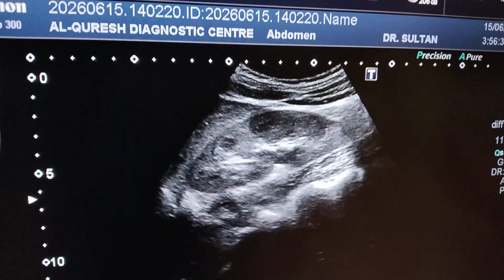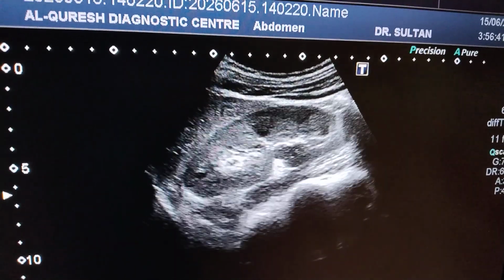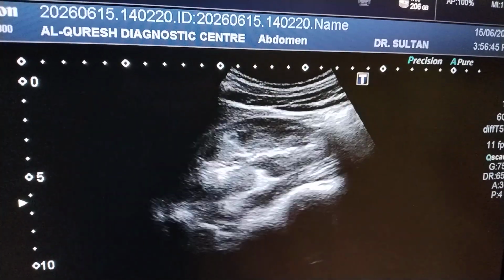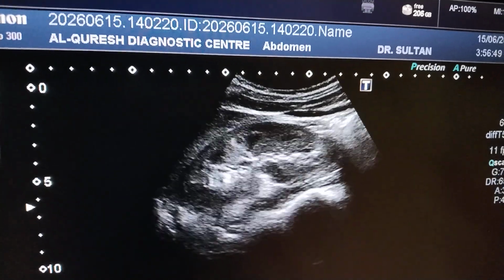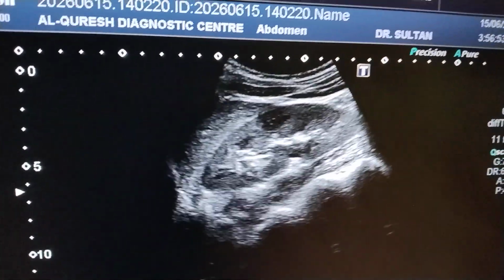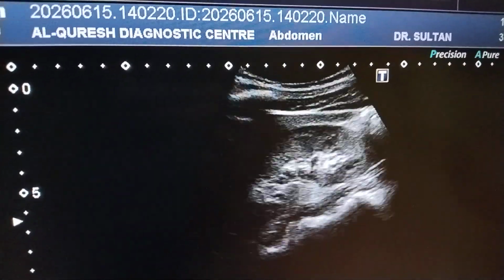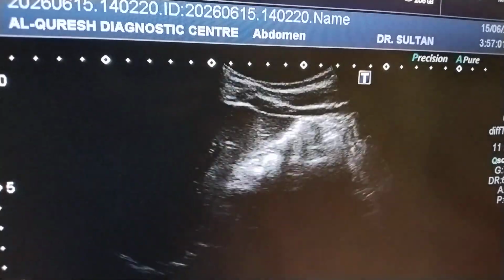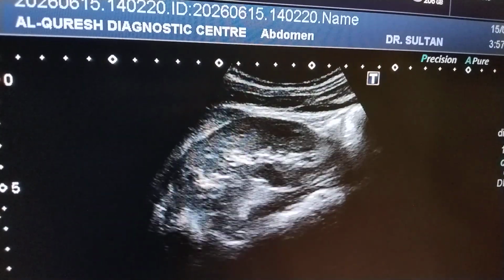My dear colleagues, I am Dr. Sultan Ayub, working as a radiologist. Today we are going to scan the normal kidney, what is the appearance, its anatomy, somewhat detailed sonographically, which we can see. So I'm going to scan it and tell you some detail of the kidney.